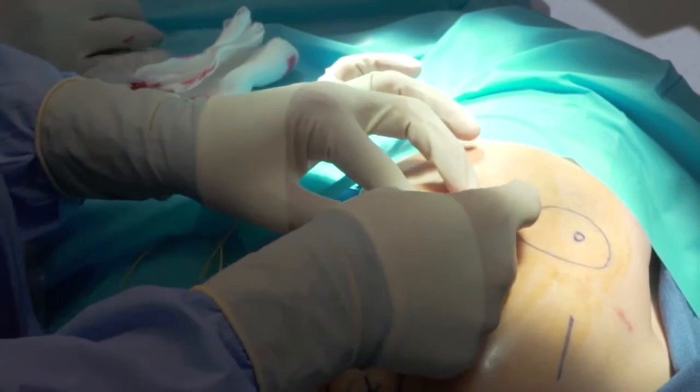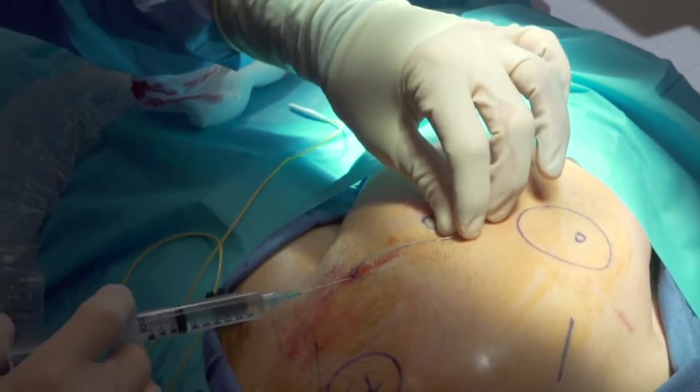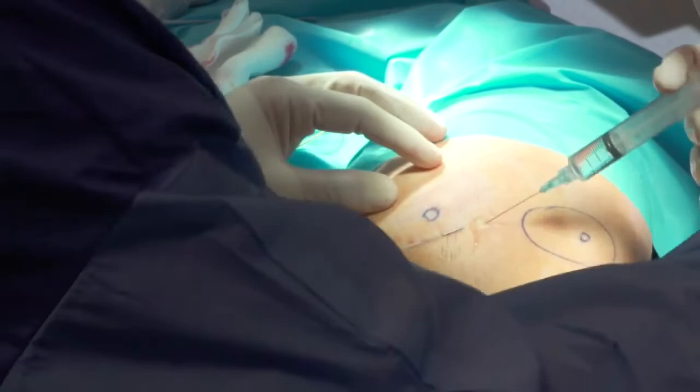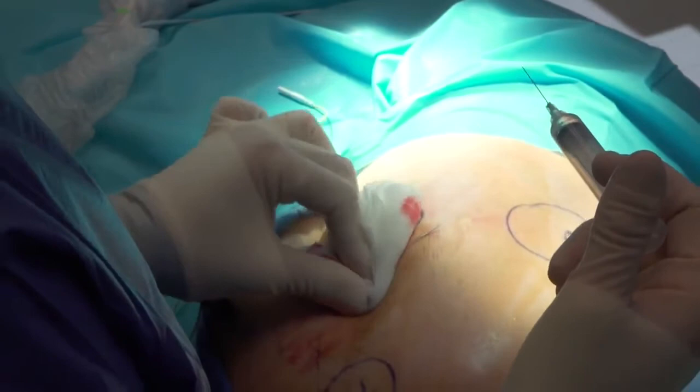All right, so we're going to go right about here. Now, if I can have some local. What I'm going to do first is go through the localized segment. You did great, John. You're almost done. Then I'm going to localize our exit point. Good job, my friend. I'm going to localize the other direction as well, just because I really don't want my friend here, because he is under local anesthesia only. And that's really how I recommend you do it.